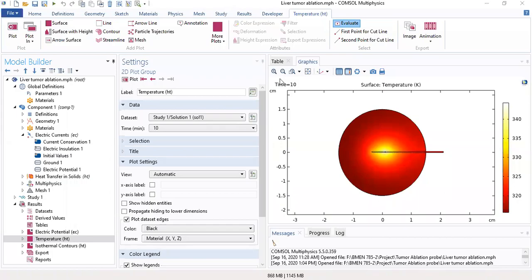Hello everybody, and welcome to the Tumor Ablation Probe Module tutorial in COMSOL. What we will be doing today is making a model like this.